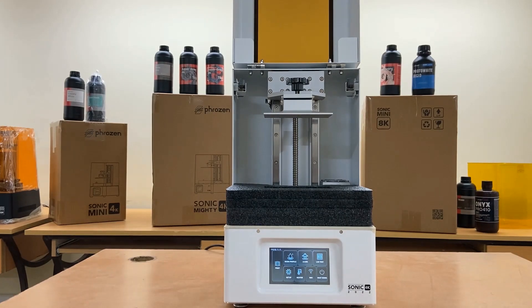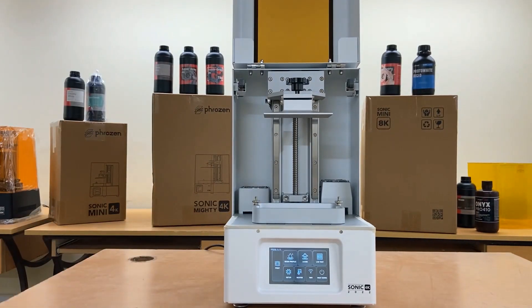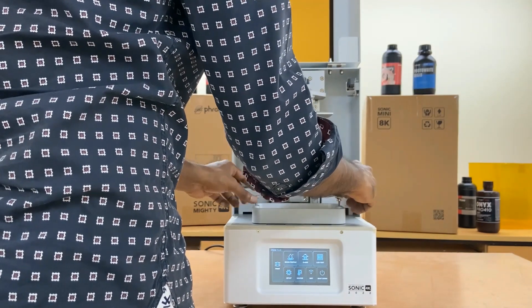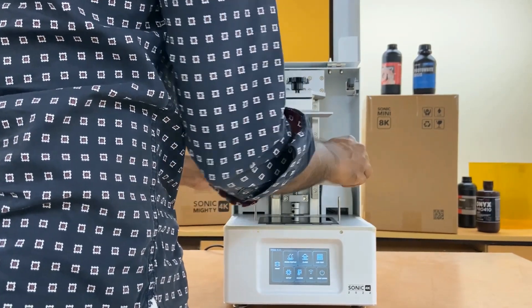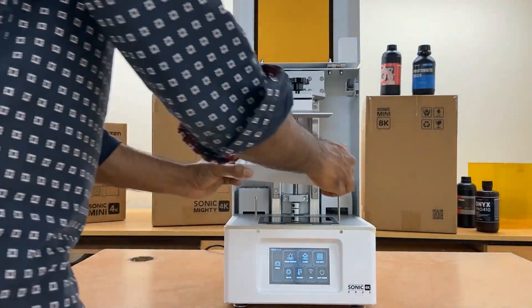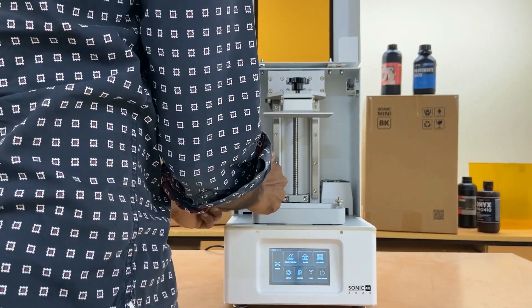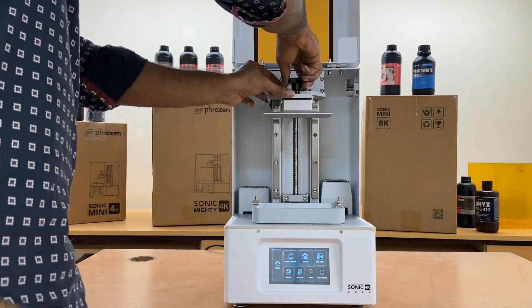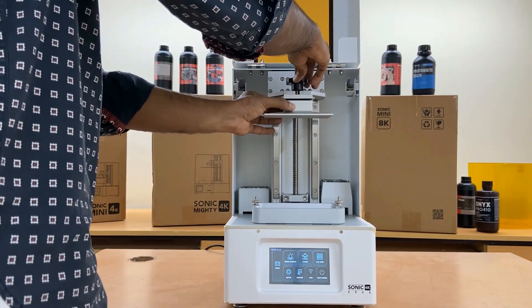The Sonic XL 4K 2022 is equipped with an internal heater to keep a constant temperature printing environment. This heater warms up the entire printing area rather than only heating up the resin vat. It also comes with a brand new air purifier system that clears resin fumes and a specialized door buffer for an enhanced 3D printing experience.